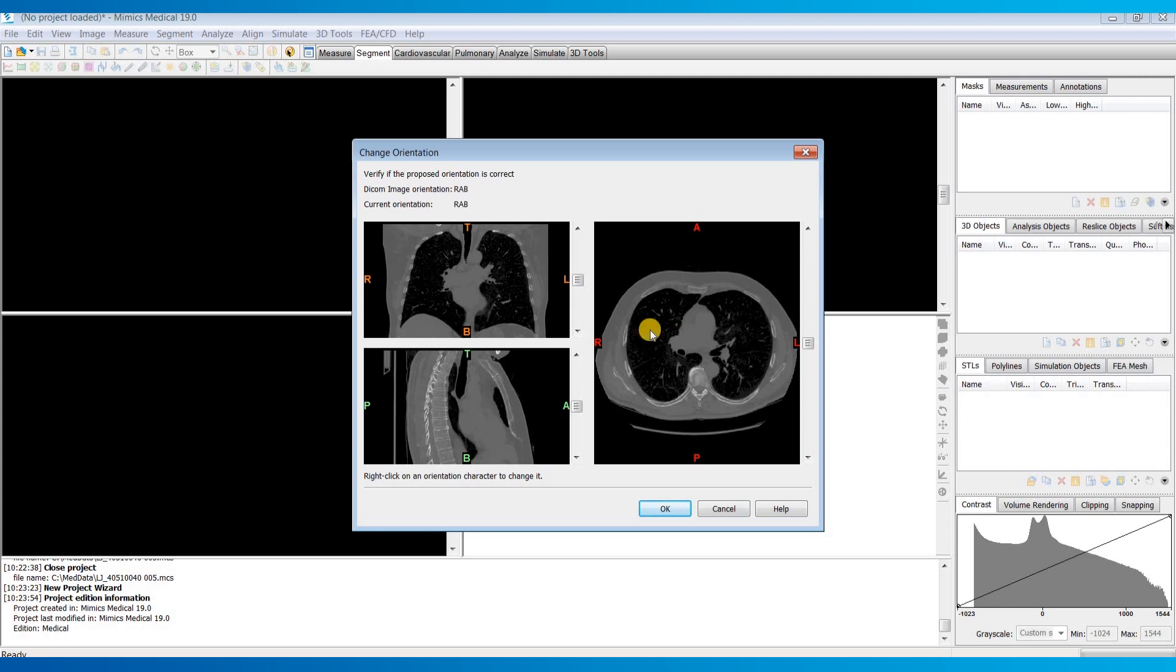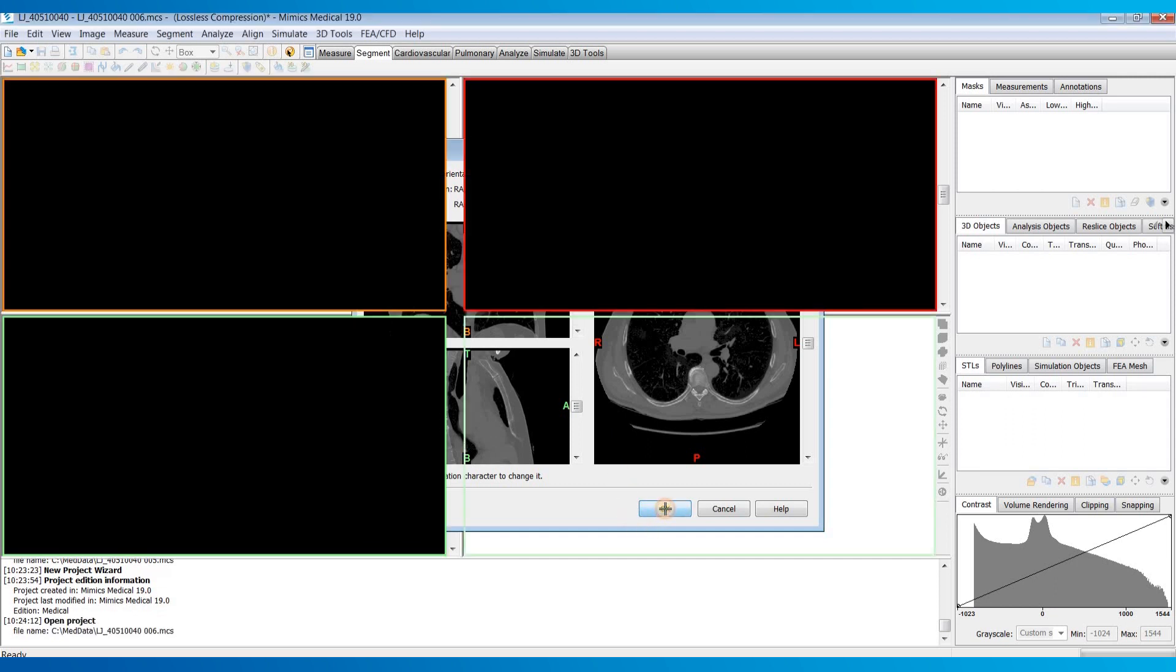Here it's just asking me to confirm the orientation of my images. Since it pulled this information from my DICOM headers it all looks okay, so I'm going to just hit okay.